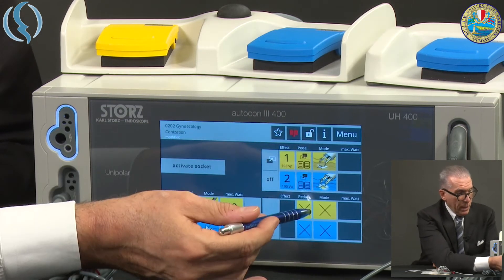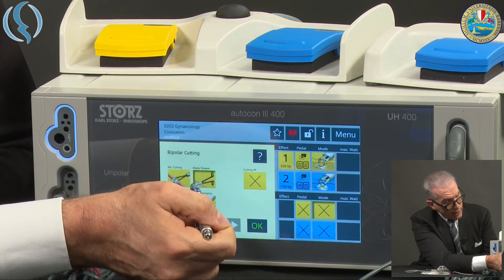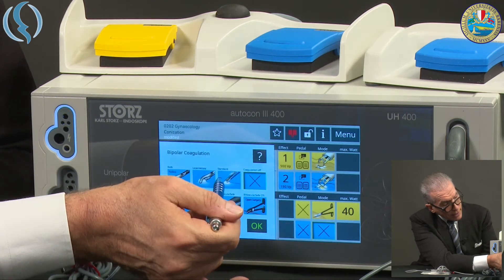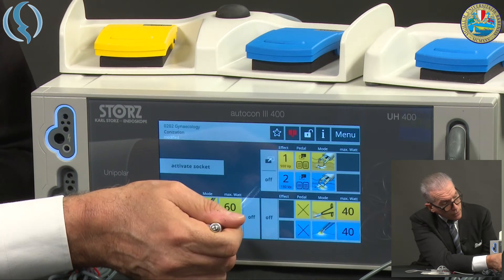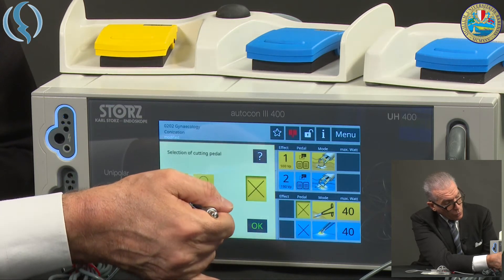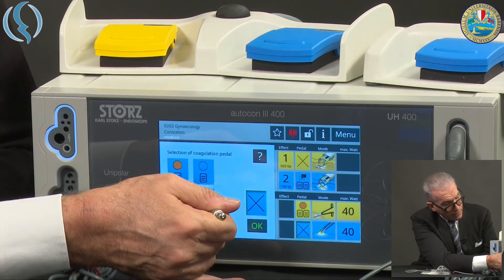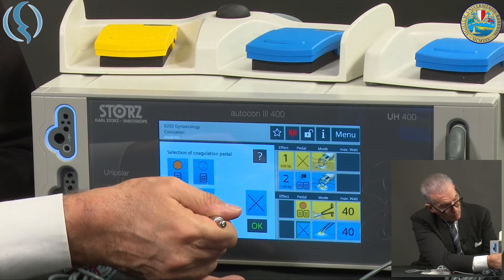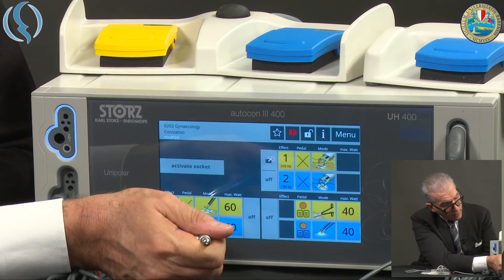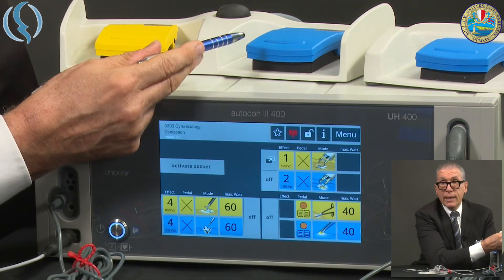Let's go now to the bipolar mode. I choose one mode — bipolar scissors — confirm, and classic bipolar coagulation. I connect them to the pedal with the highlighted button. You see I choose between the double pedal and the single pedal. Now I have the bipolar mode ready, working on the two-pedal mode.